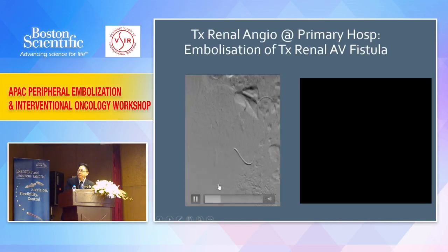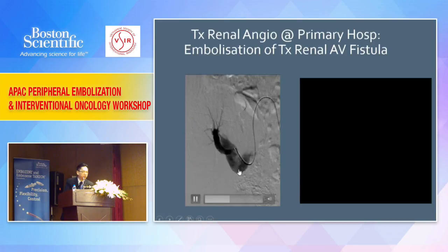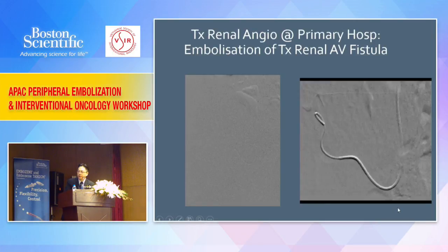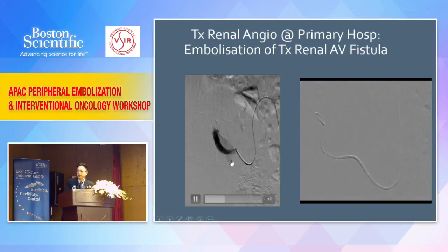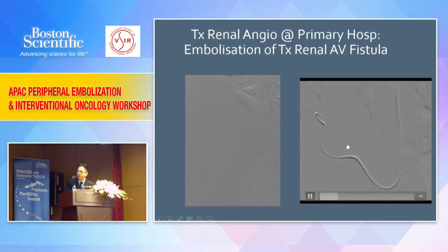This is another patient, a young boy with renal transplant, and on the ultrasound detected AV fistula, huge AV fistula with peak systolic velocity of about 367, and attempted embolization by a junior trainee radiologist. The senior went OC, so took the angio room under GA, put the catheter in, and see how fast it's a shot.